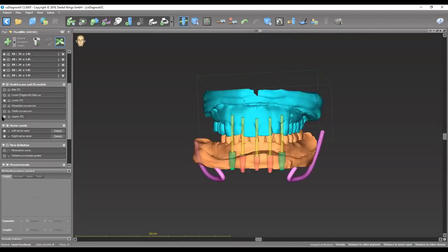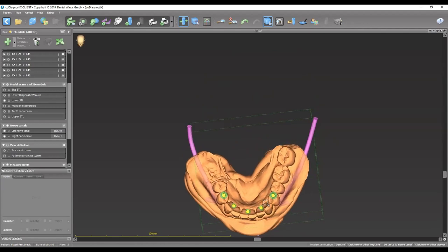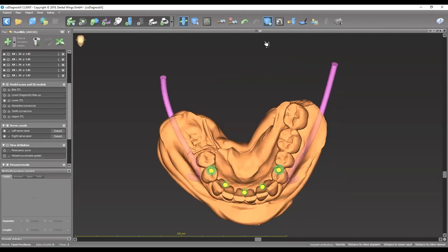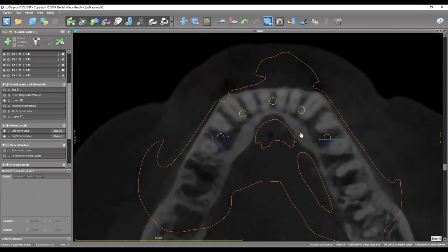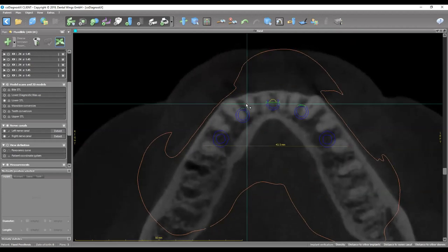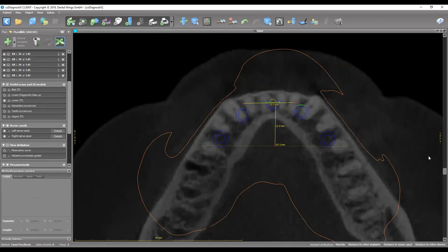Looking at the occlusal view of how those implants look — they're perfectly parallel to each other, emerging from the first and second bicuspid or first bicuspid sites on each side, the canine sites, and one in the midline. Measuring the AP spread: drawing a line crossing the distal aspect of the posteriorly placed implants and another line crossing the midline of the most anterior implant — that's around 13 millimeters.